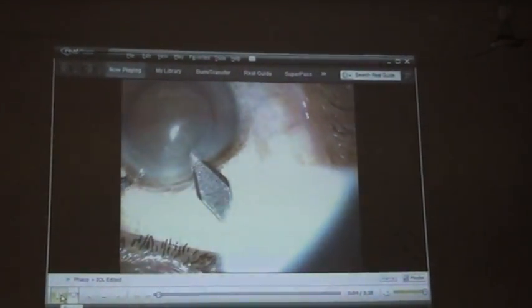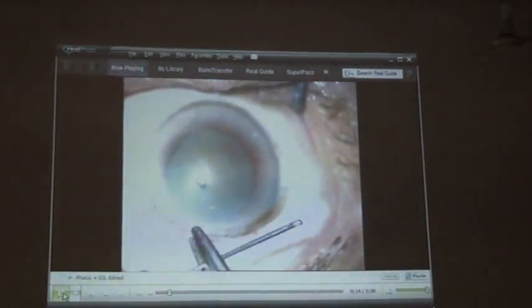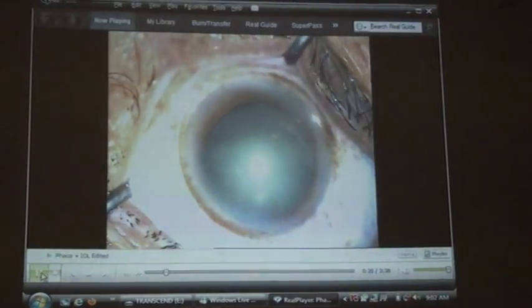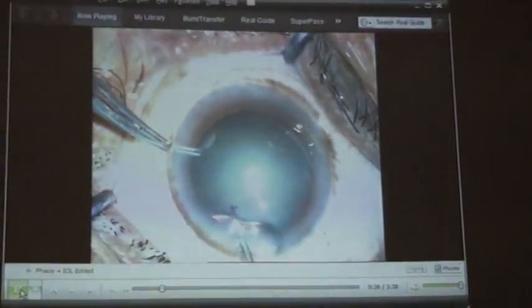The usual entry wound. This is around 3 minutes 20 seconds. Local xylocard within the anterior chamber for anesthesia. No regional block, nothing. This surgery is being done just by topical xylocaine drops and intraocular xylocard.